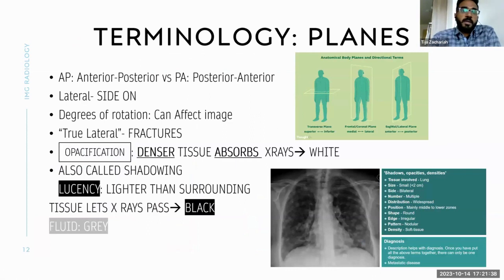Okay. So coming to the basic principles of X-ray, as Karthik said, there is a source from where the X-ray is being emitted, and then there is the media, that is usually the body part that we need to image, and then we have the detector, which detects the radiation that is passing through this body part. Now, the basic principle is obviously that some parts of the body will absorb the radiation and the others will let the radiation through. And the detector basically detects these radiations that are passed through.